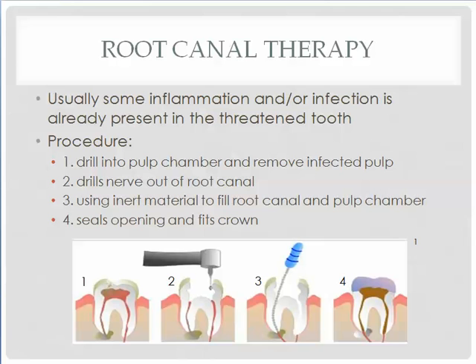As previously mentioned, root canal therapy is a common procedure for endodontists. By discussing the optical tools for the root canal therapy, it will serve as an overview of the ergonomic gaps and solutions for endodontists due to its high prevalence.